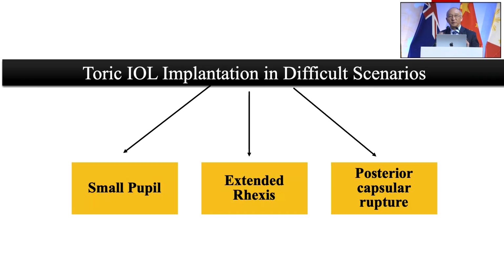I wanted people to understand these lenses are also available and the calculation can be very simple. And instead of trying to exchange the lens, which they showed is totally damaged, especially where people have done a large YAG capsulotomy, things can be very tough. If you can implant these piggyback lenses, things can be very, very simple.